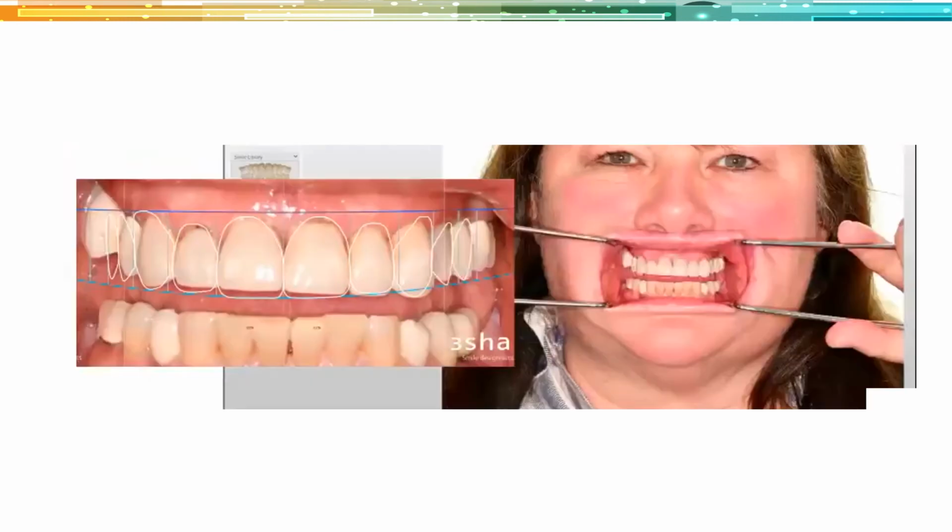And so now it goes to the laboratory. I'm going to send the same photography to my laboratory, which is why I have to take really nice portraits. They're going to align the intraoral scan from the TRIOS onto that portrait photo, the retracted portrait photo. Now it's up to the laboratory technician or the designer to basically interpret the two-dimensional picture on the left and create a 3D wax up.